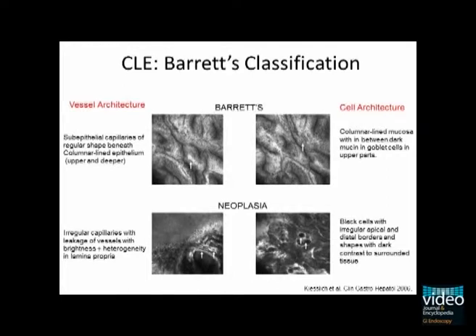In contrast, Barrett's neoplasias show irregular capillaries with leakage of vessels with brightness and heterogeneity in the lamina propria. The cellular architecture in neoplasias show black cells with irregular apical and distal borders and shapes with dark contrast.